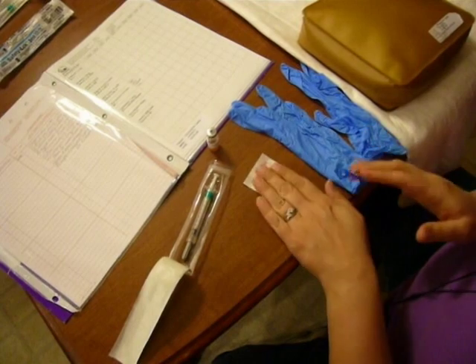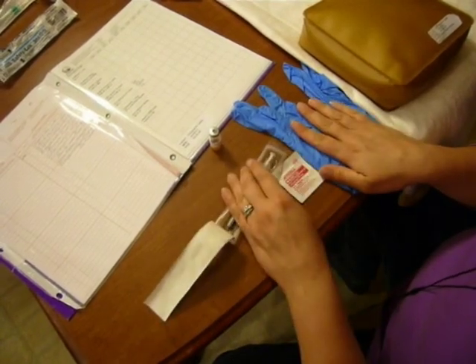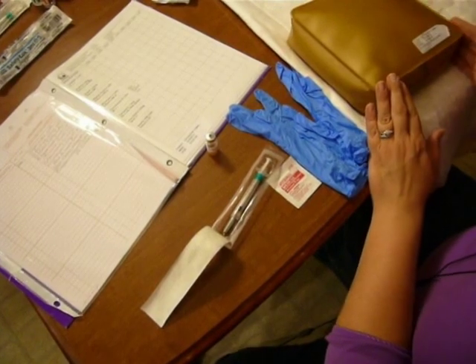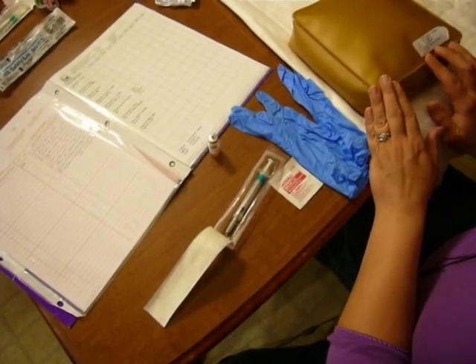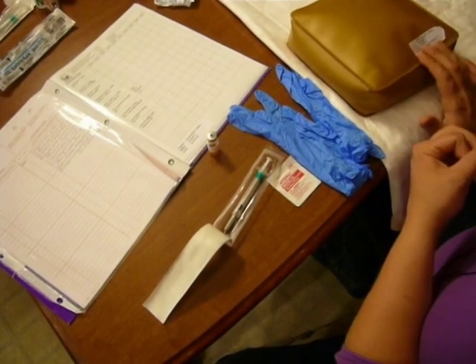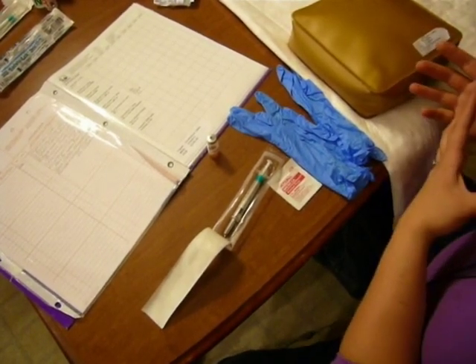I need to wash my hands. I need an alcohol swab, gloves, and my injection. When I get into the room — now of course this is our inject-a-pad, so it's not a real patient — but when you're with a real patient, you need to make sure that you check their armband for two patient identifiers: have them spell their last name, their birth date, or something else.